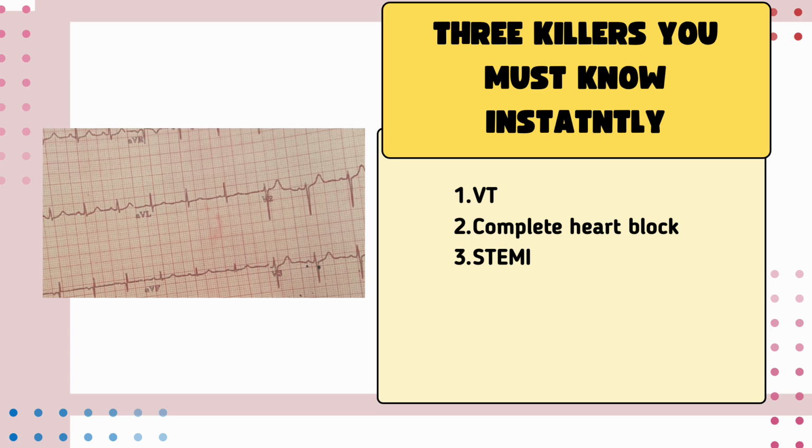Because if they have a myocardial infarction, they need to be transported within the first few hours to a cath lab for coronary interventions. So it's very imperative that as the first doctor, clinician or paramedic seeing the patient, you are able to read this MI, read that there's ST elevation on this strip, and call for help, right?